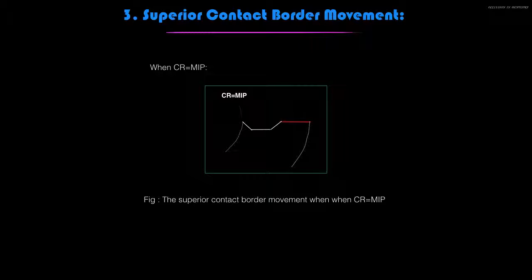Here is the slide showing superior contact border movement when CR equals maximum intercuspation.